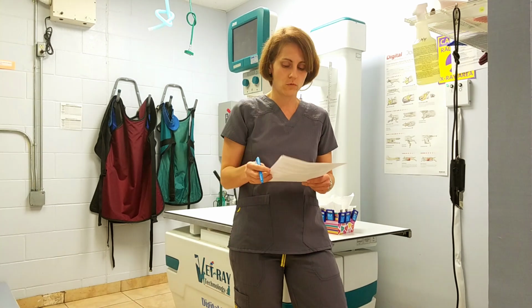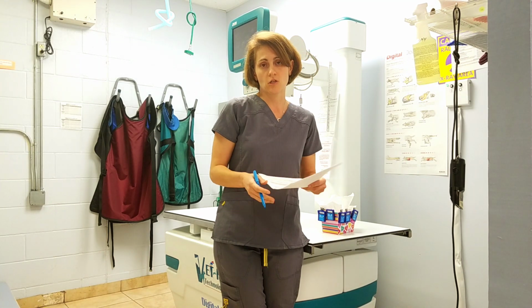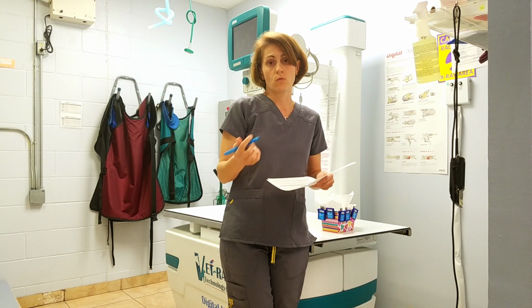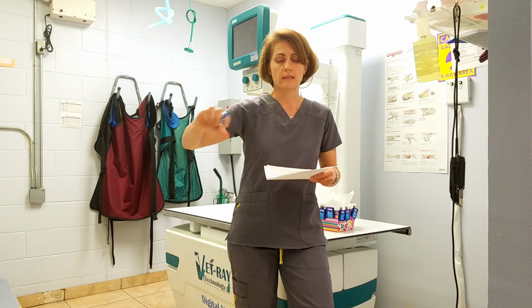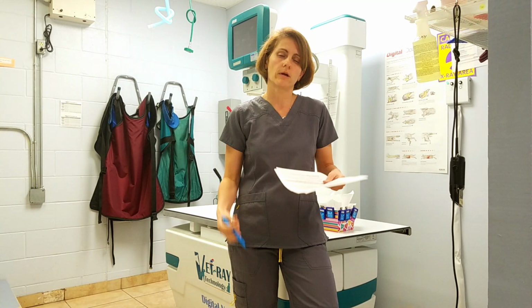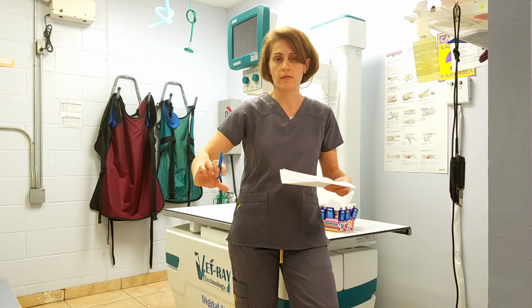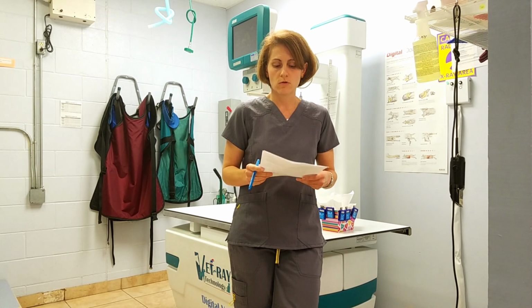Also, with regard to the protective devices, if you are shooting x-rays, you should be wearing lead. That means the apron, the thyroid shield, and the gloves. If you're not able to get the shots that you feel like you need with those devices on, then let the vet know. We need to do something to change the situation. The change can't be that you wear less of the protective equipment. With the exception of shooting dental x-rays, it's slightly different. You should still be wearing an apron and a shield. Your hands shouldn't be really on the pet while shooting that, but the gloves wouldn't really be feasible for that.